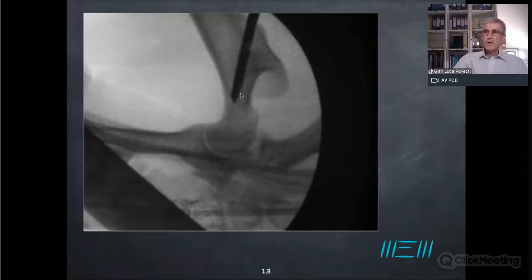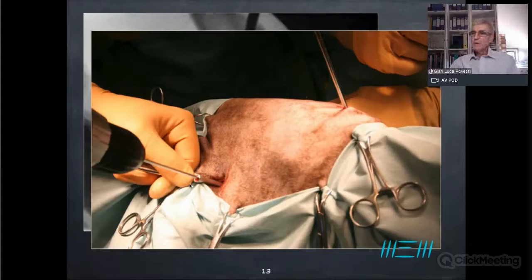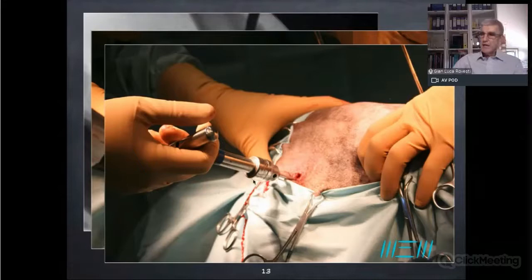I insert a threaded pin into the femur in the trochanteric area, like this, okay? So I will insert this threaded pin through the trochanteric area. This is the reason why I need an extended surgical area that has been scrubbed, okay? And once I have this threaded pin inserted in the trochanteric area of the femur, I will put a Jacobs chuck on the threaded pin and I will progressively pull.